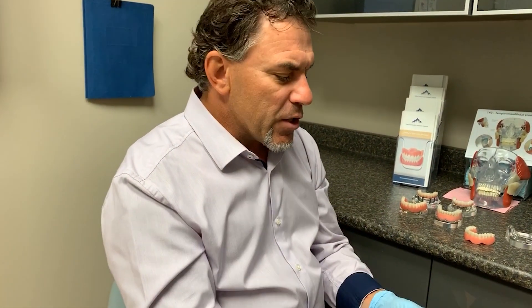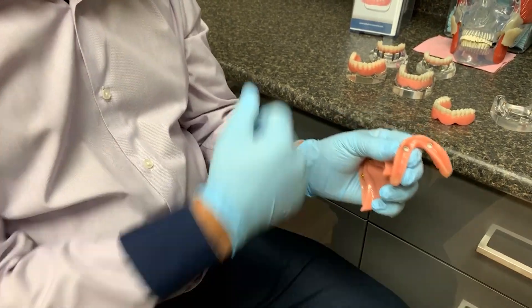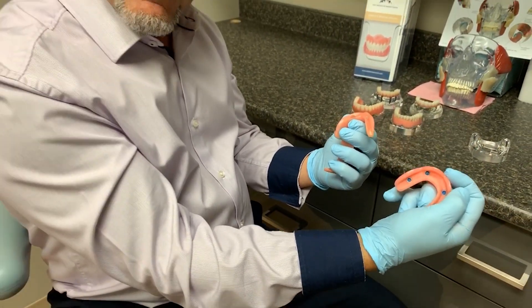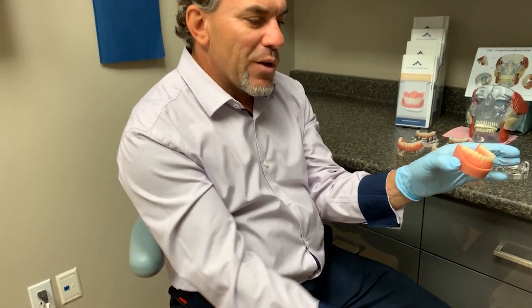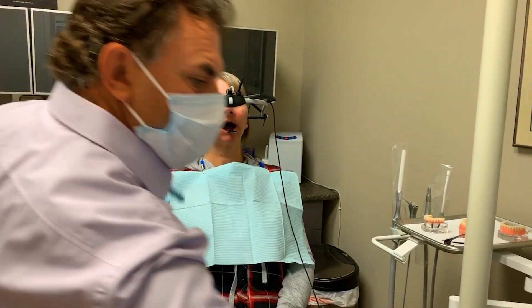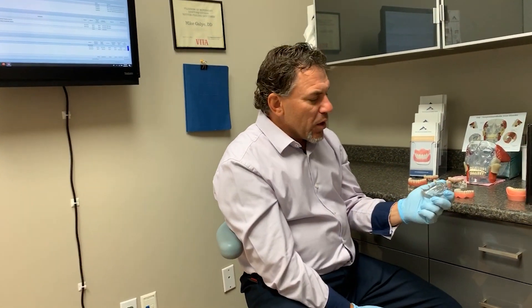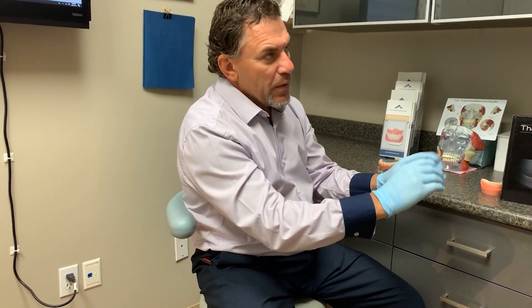Two implants in the front with snap-in attachments inside the denture was the original idea, but we would still get a little rock in the posterior of the denture. As patients get implants, they challenge their function — they want to eat harder foods — so we need to stabilize things. The traditional staple system in the marketplace is typically four implants for cross-sectional support, with attachments inside the denture that snap in.